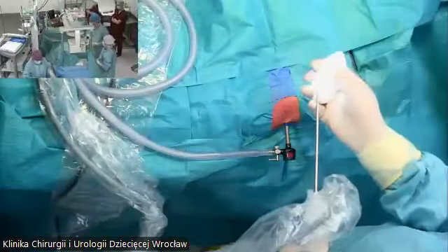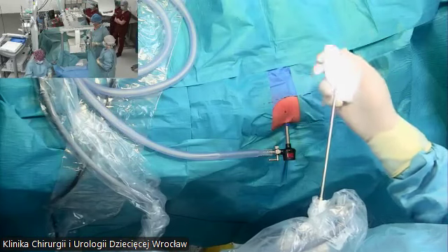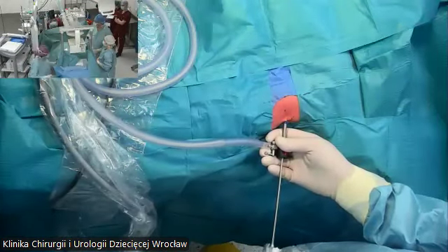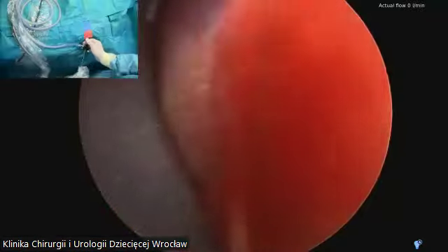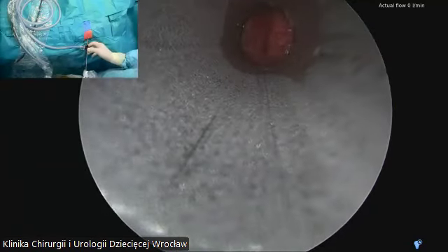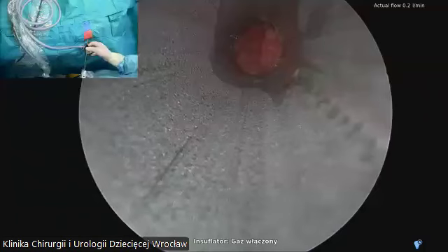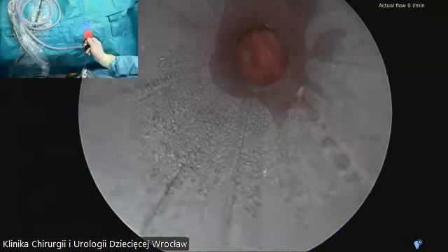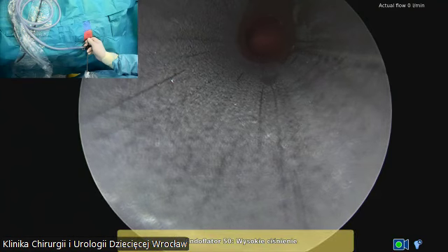Our anesthesiologist, we have a great team today, was a little bit surprised that we already started with insufflation and there was no drop in saturation. Okay, so we are already in the chest. As you can see, right now we have almost no space. Okay, the insufflator was not switched on. Right now you can see that the lung is going down.